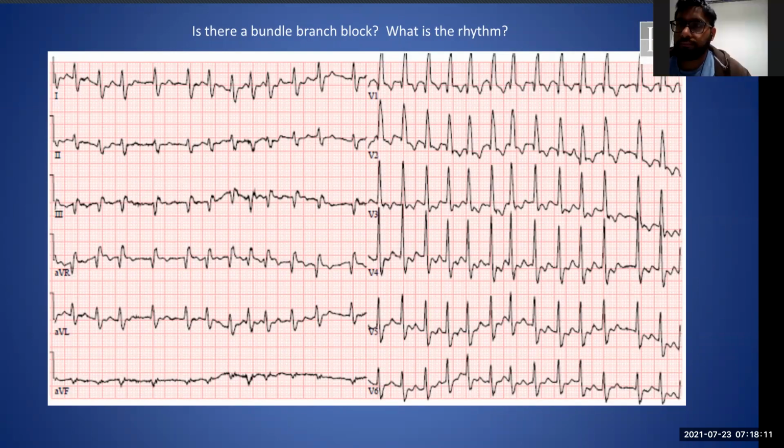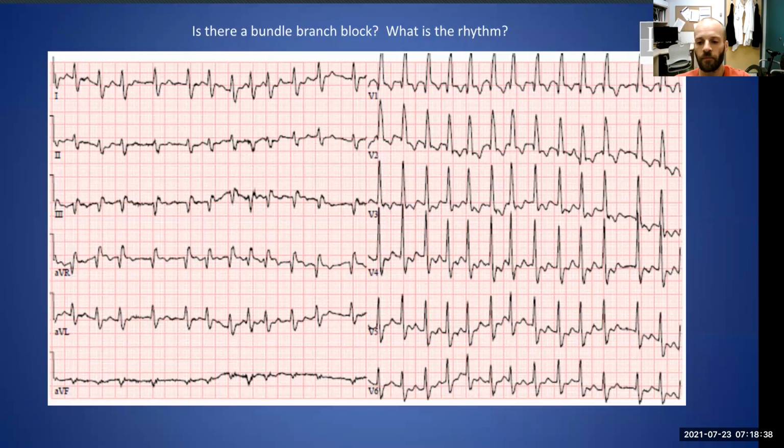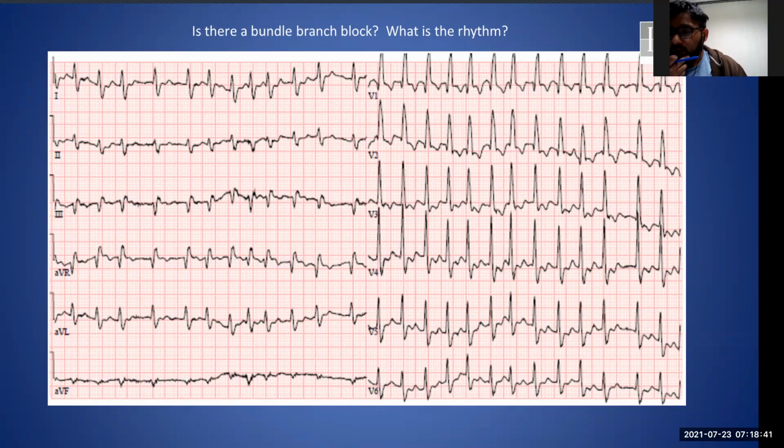So why did, oh, sorry. You cut off there. What was the question? So what made it that it was VT? Well, one, the rate was 150 beats per minute. So it's fast. So that tells me that it is tachycardia. And what I had assumed, instead of it being an RSR wave, I assumed it's the P waves merging in with the QRS.